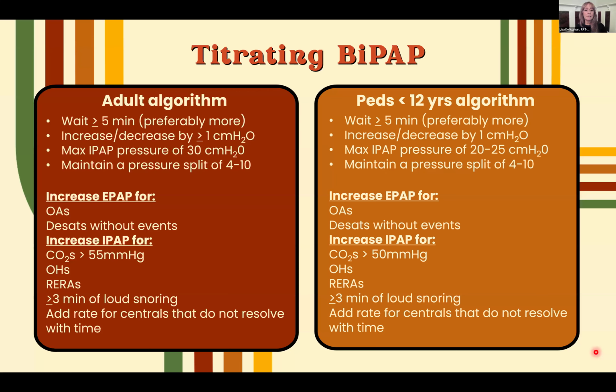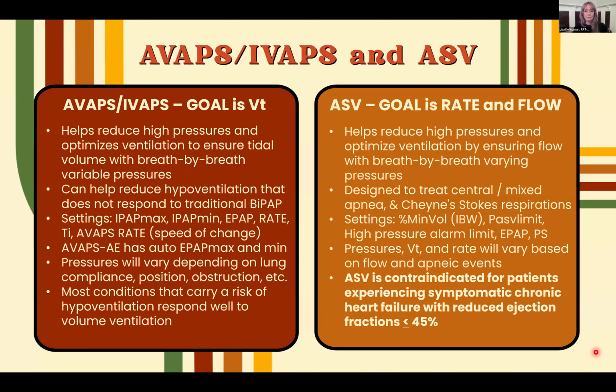You can increase EPAP for desats and sometimes IPAP, right? If we need a little more PEEP to help hold those alveoli open, the EPAP can help. And we're going to add rate for centrals.